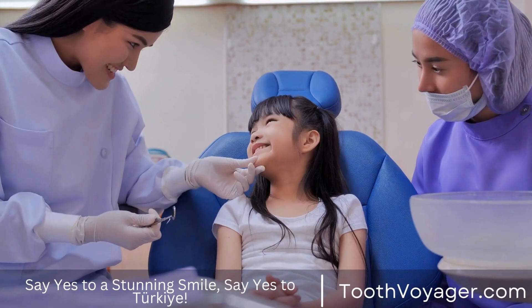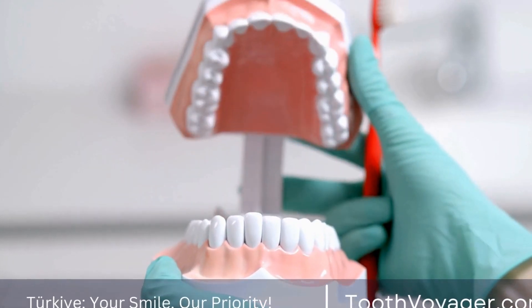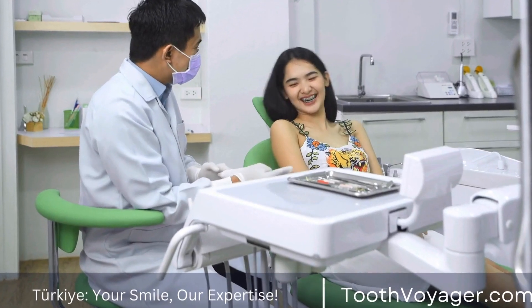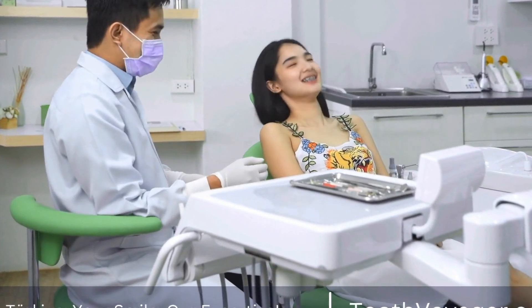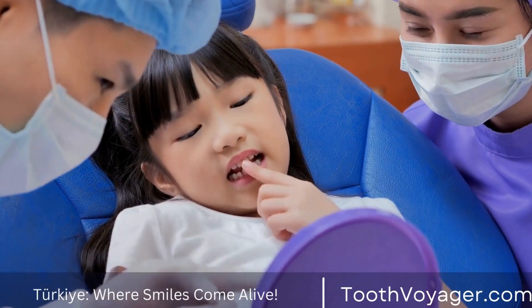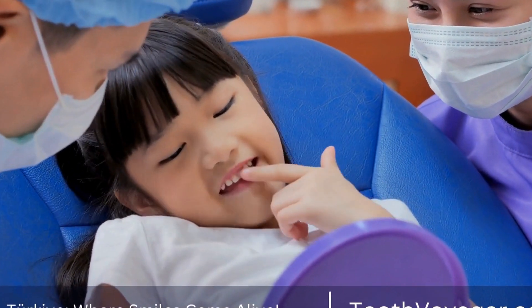The Finishing Touches. Once the crown is fabricated, it is ready for placement. The dentist will carefully bond the crown to the existing tooth, ensuring a tight and secure fit. This step is crucial to ensure that the crown functions properly and blends seamlessly with the rest of the teeth.